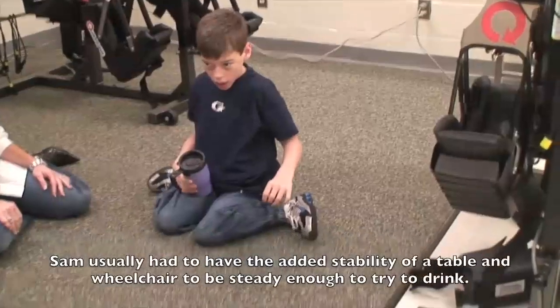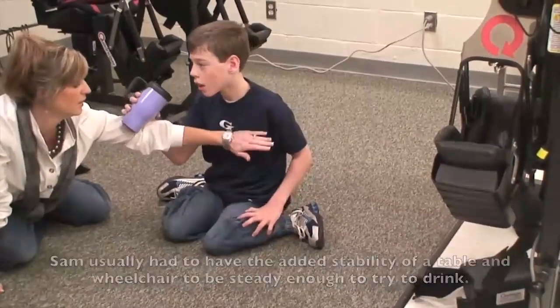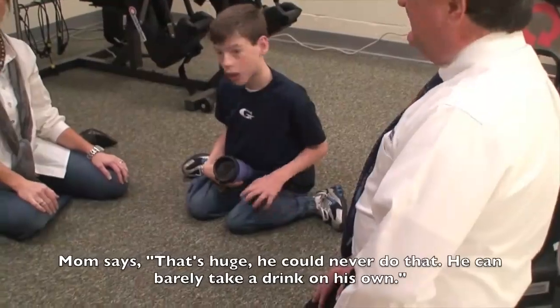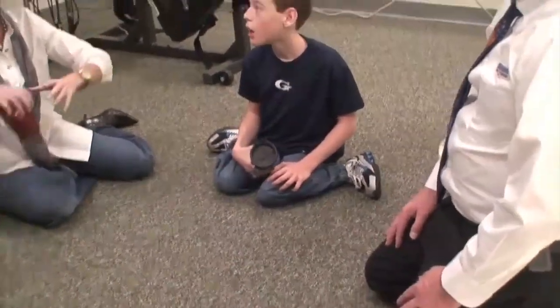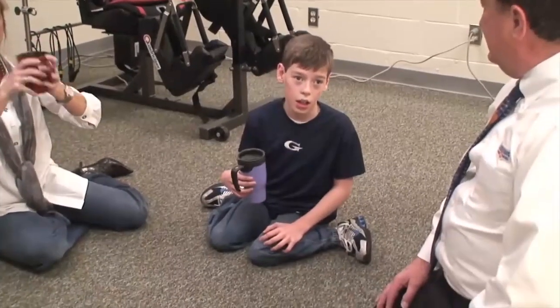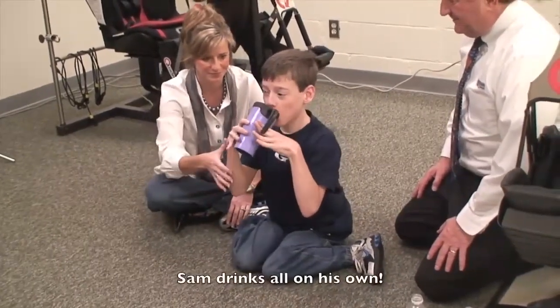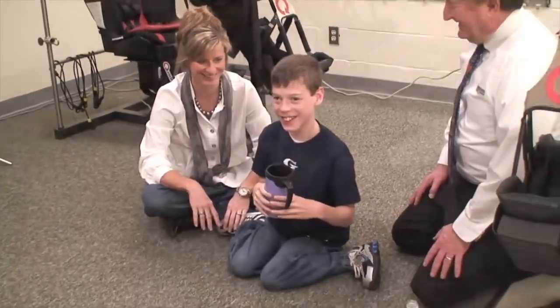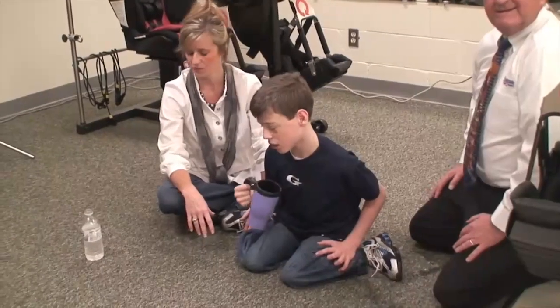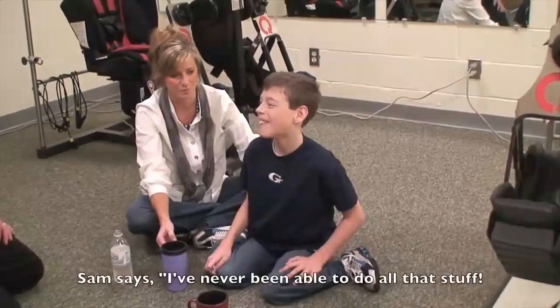Even in his wheelchair sitting at a table with support, with his left hand holding the table, a small juice box is very difficult. But if he had a table support, he could do it one-handed — and he just did. He could never do that before. He can barely take a drink on his own — he puts his elbows on the table, grabs the cup, but the minute he starts bringing it to his mouth he's afraid he's going to fall or spill. That's very good. I've never been able to do all that stuff or raise my hands up.